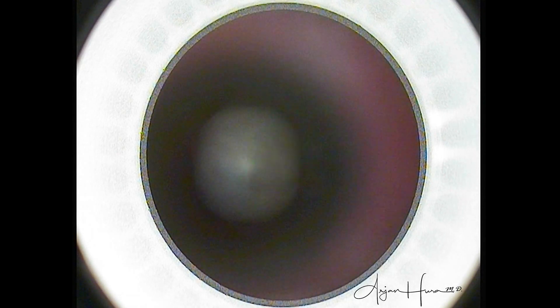The docking of the laser on the eye may seem a bit de-centered here in a minute, because it's not on the pupillary axis — but this is very intentional. For SMILE, the treatment has to be centered on the patient's visual axis, not the pupillary axis.